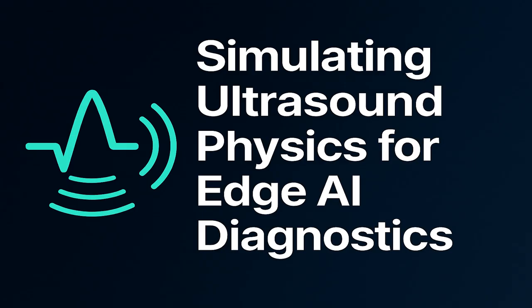That's the end of that line. The B-mode image is absolutely crucial for anatomy, but ultrasound offers a unique capability in medicine, visualizing movement, especially blood flow. And this brings us to Doppler processing, which is our primary tool for measuring velocity.